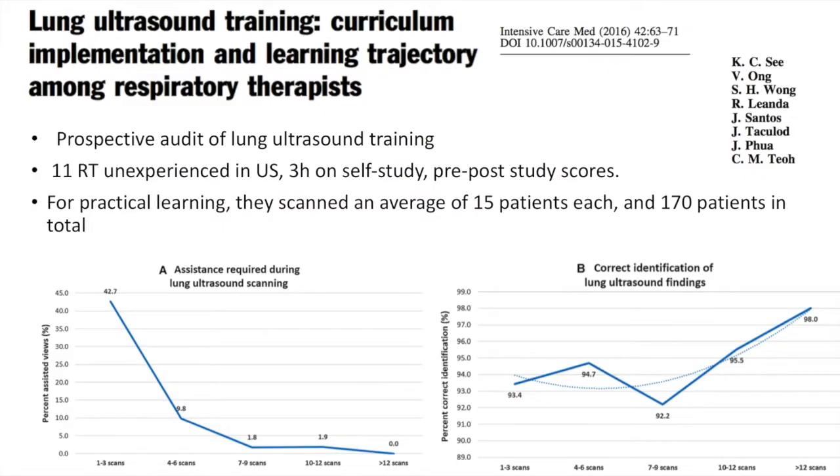What about the training? The good news is that it is much simpler than echocardiographic training. This study is a prospective audit of lung ultrasound training. 11 respiratory therapists, unexperienced in lung ultrasound, had first 3 hours of self-study. Pre- and post-study scores were then compared and assessed their image interpretation competency. For practical skills learning, they scanned an average of 15 patients each and 170 patients in total. The supervisor took over when the respiratory therapist took more than 1 minute to acquire a view.